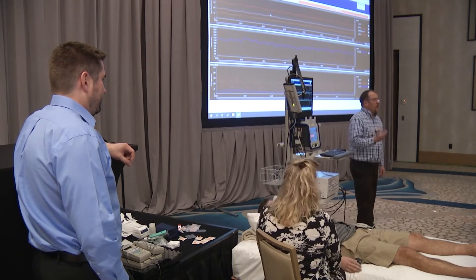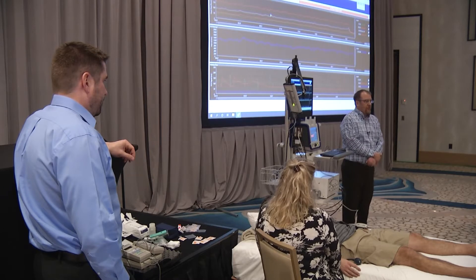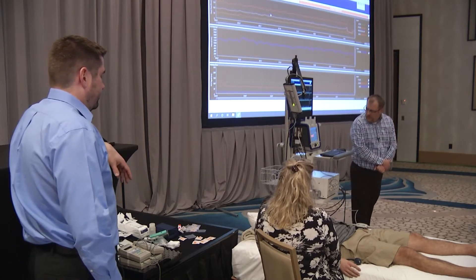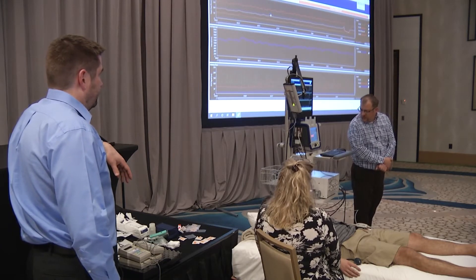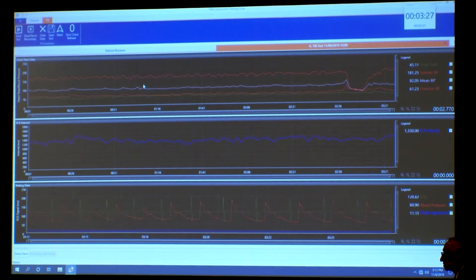In our lab we keep the room at 78 degrees — room temperature is extremely important for these reasons. After recalibrating, he's now showing 135 over 77.